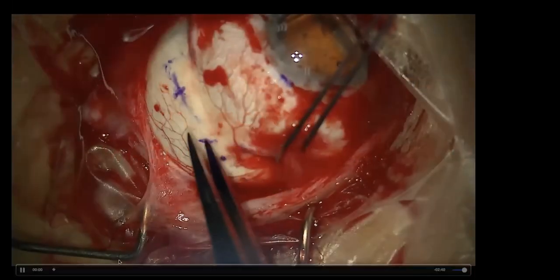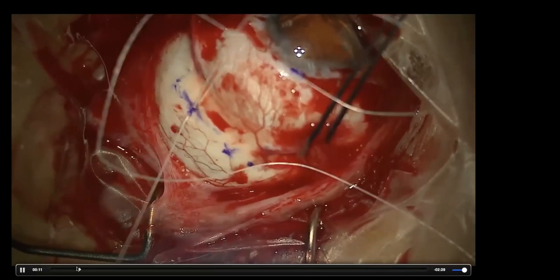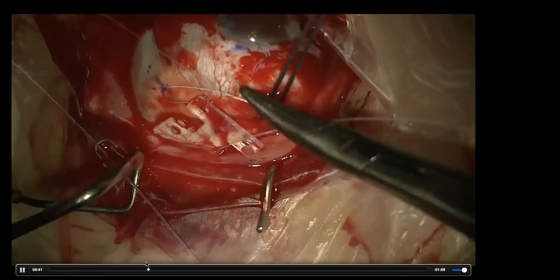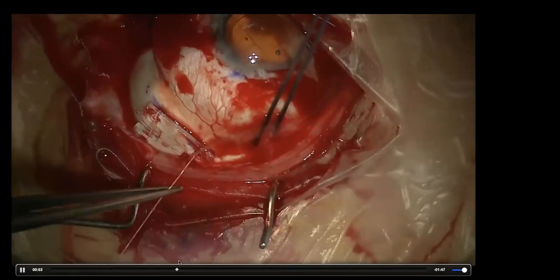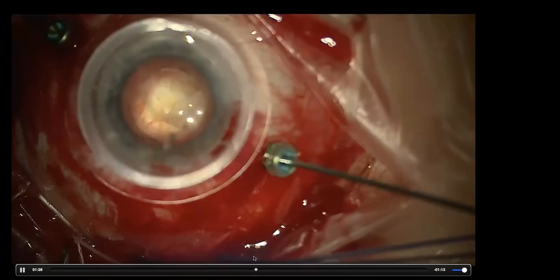This is another example of surgery combined with vitrectomy. In the same way, I pass the suture, insert the buckle, I place the second suture, I place the contact lens and check the macula.